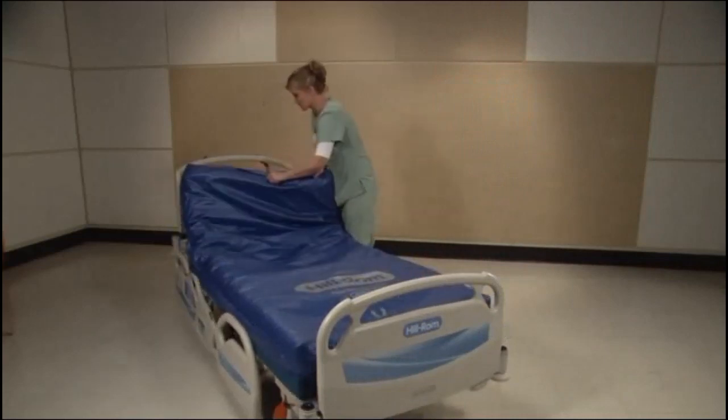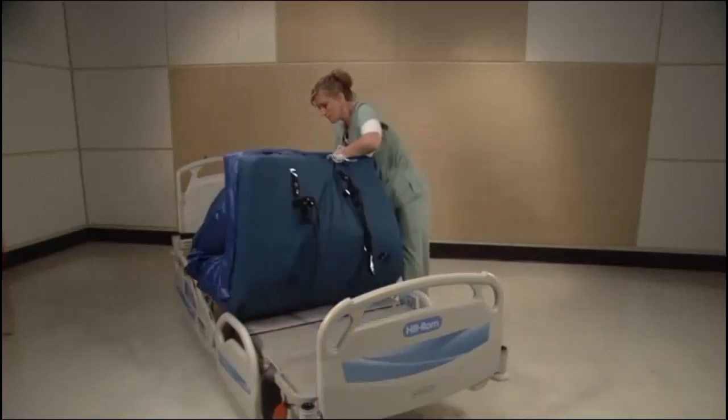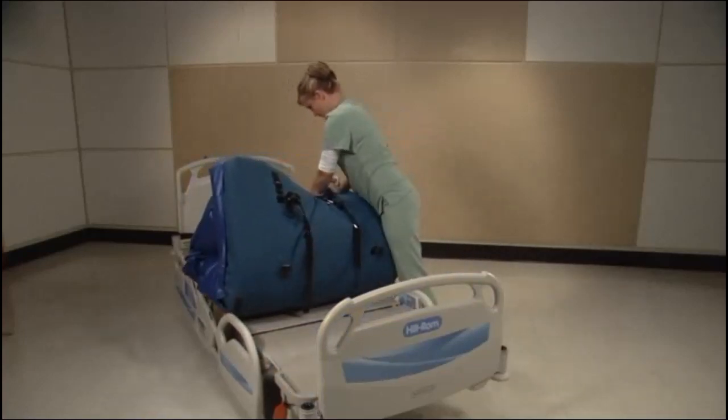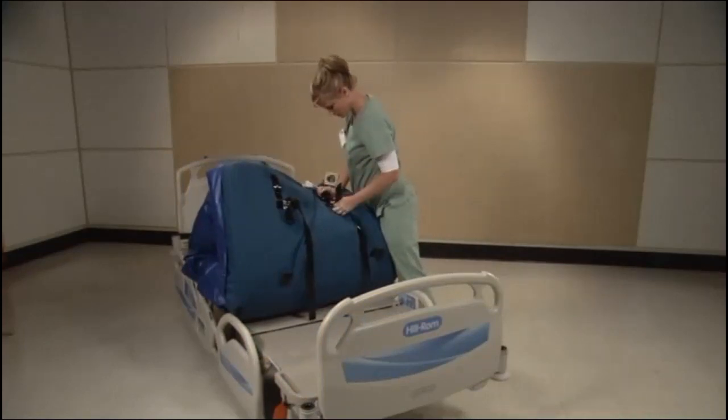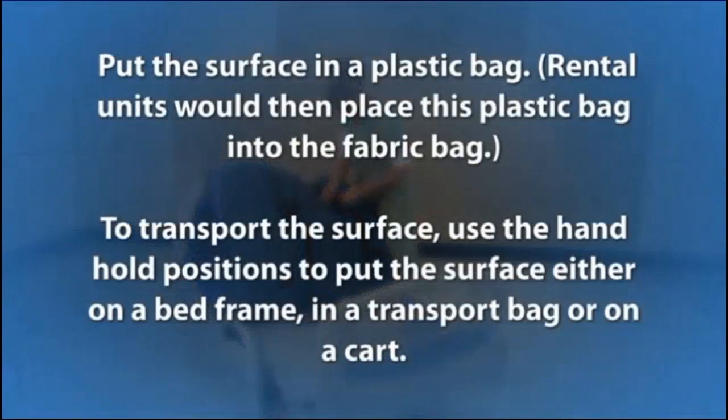Once the surface is completely dry, fold the surface into 3, starting with the head end of the surface. Then bring up the foot end and connect the straps to keep the surface folded. Put the surface in a plastic bag. Rental units would then place this plastic bag into the fabric bag.